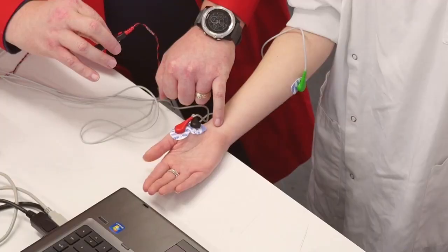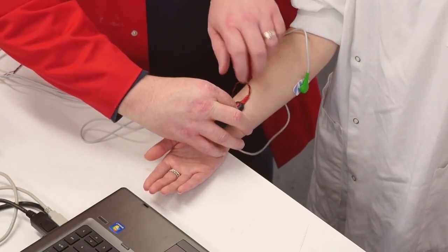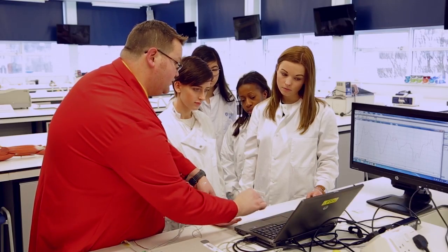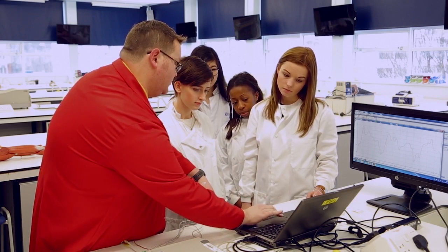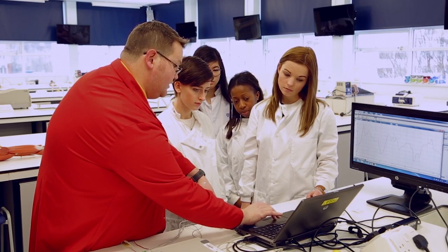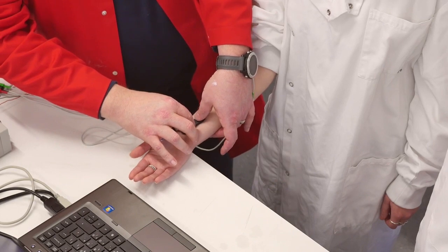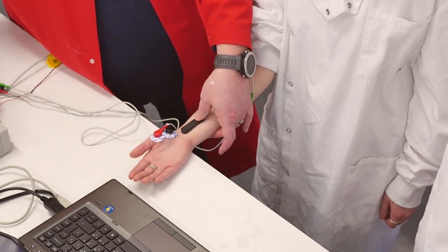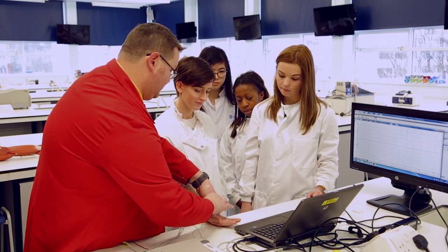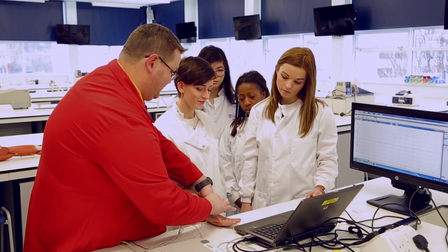We'll find the median nerve and place our stimulating bar where we know that track should be. We've got our amplitude set to about 12 milliamps and our duration is about 0.05 milliseconds, and we should — if we can find the nerve — get a nice stimulus. Obviously because we're talking physiology it's not always that easy to find the nerve.